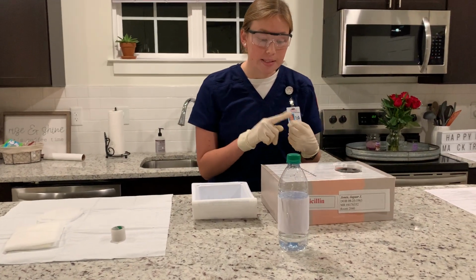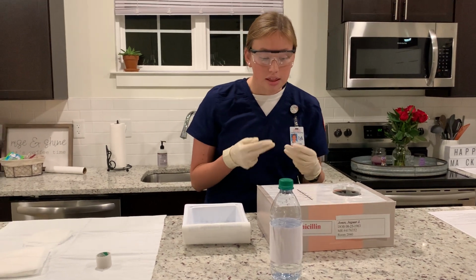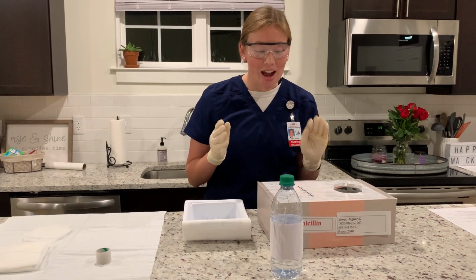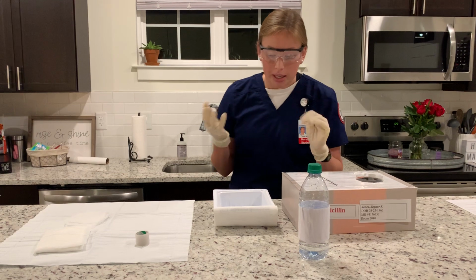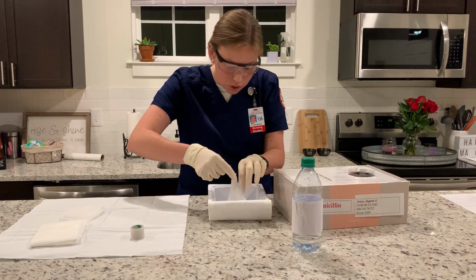Now I am going to assess the suture line. I am noting the size of the line, the approximation of the edges, the drainage, and also any other abnormalities. And if I see anything, I will note it. But now I'm going to clean the wound, the suture line.